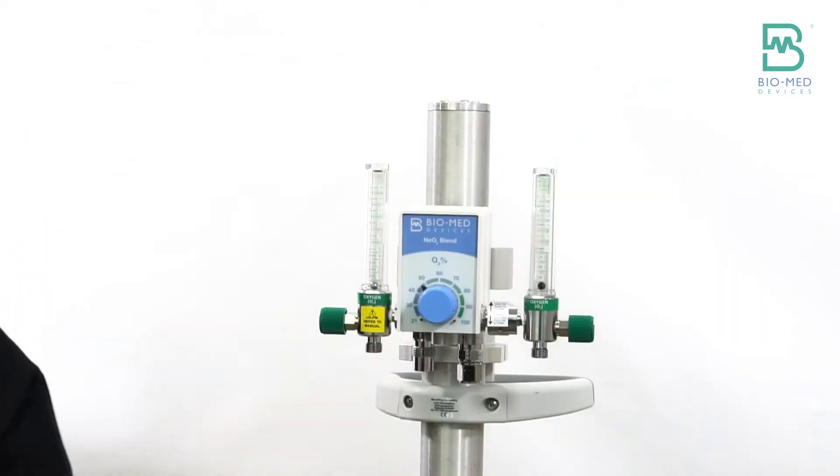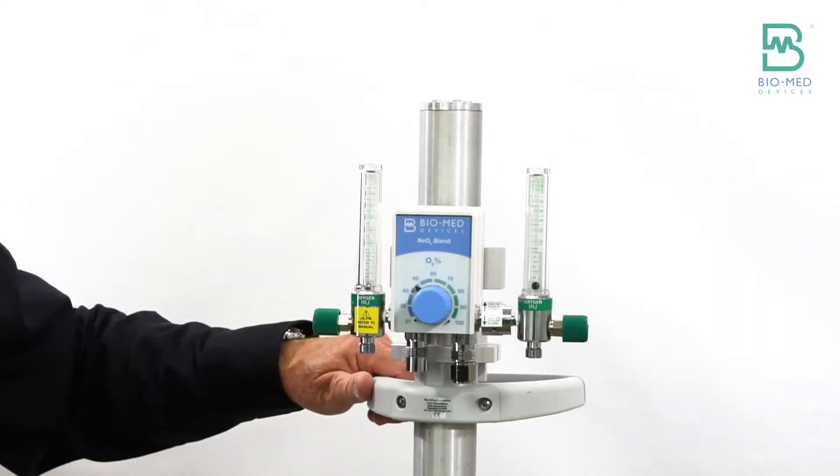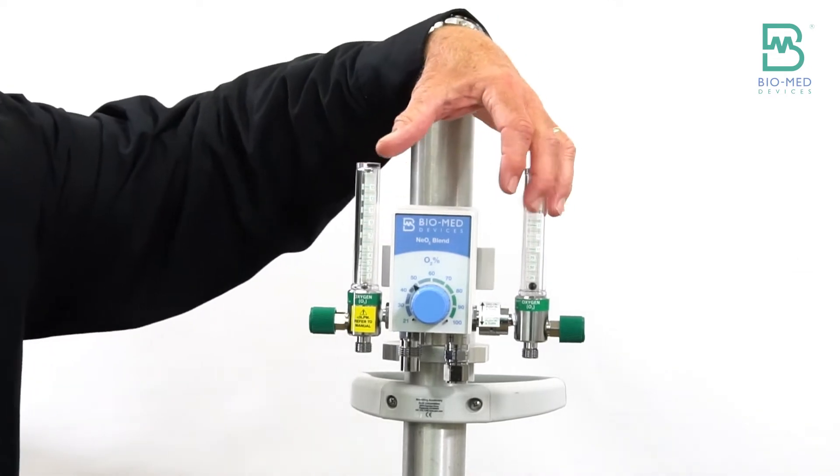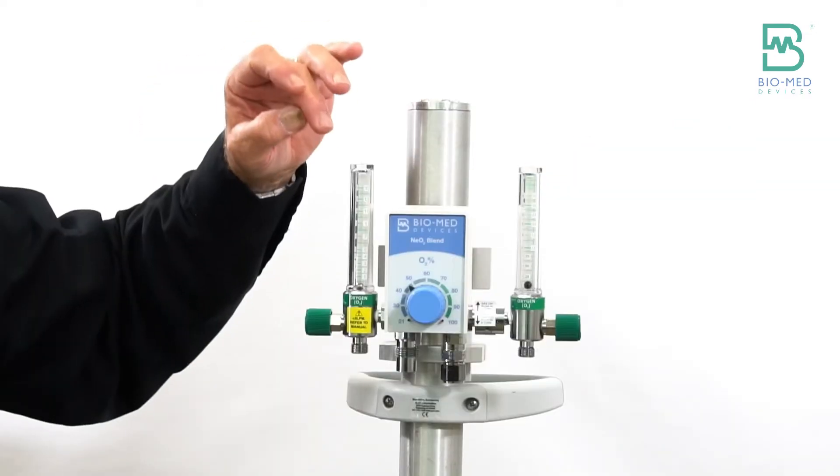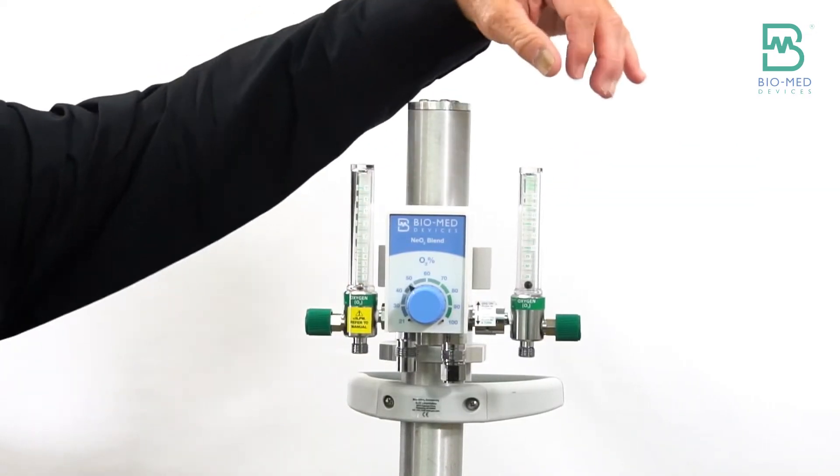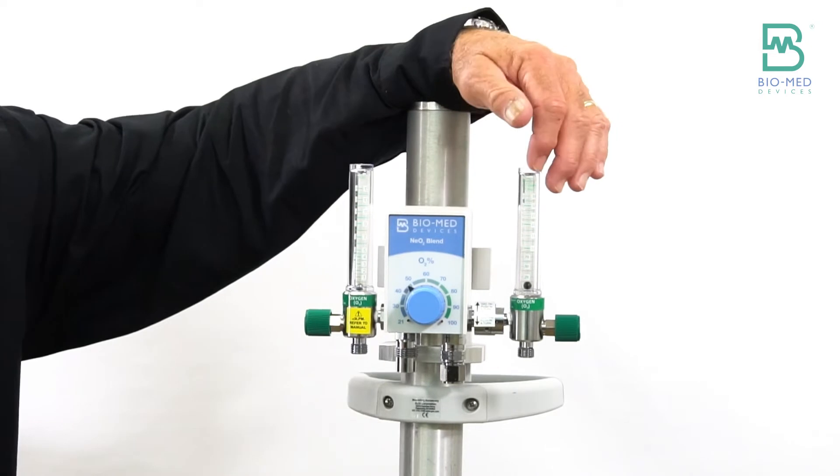So what we did is we came out with our Neo2 Blend. Rather than have the flow meters hanging out to the side, we actually hard mounted a zero to fifteen on this side so you can add your resuscitation bag.